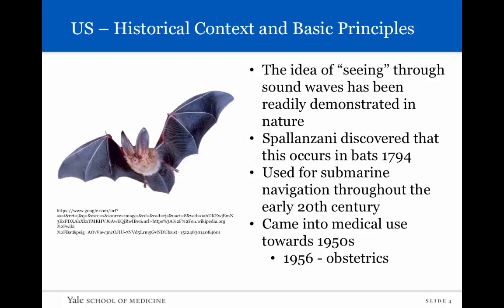It had been used throughout the 20th century for submarine navigation and only came to medical use around the 1950s, particularly in the mid-1950s, where it was used for obstetrics. And the reason that it was popular for use in obstetrics is because unlike CT imaging and conventional radiography, which use X-rays, ultrasound uses sound waves, so there's no ionizing radiation, thus there's no risk of damage through the sound waves to the patient's DNA.